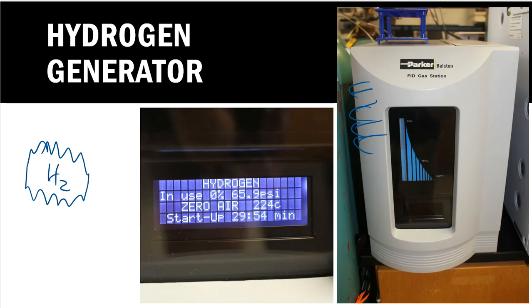All right, so this is going to require air, and it's also going to require a little bit of water. And that's how this hydrogen generator does its job. Back in the general chemistry days, you learned about a reaction where water can decompose. The only thing you need is a little bit of current, DC current, or whatever you want to call it. You just need some electricity, and it's going to break it down into H2 and O2 gas.